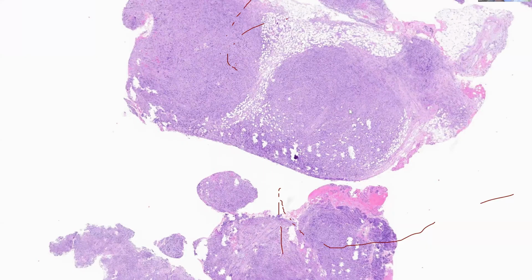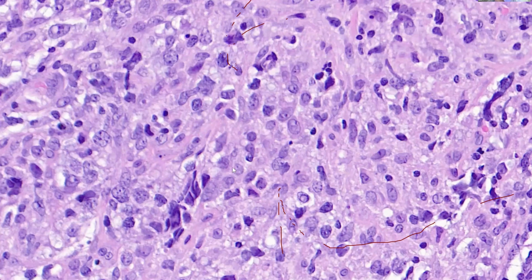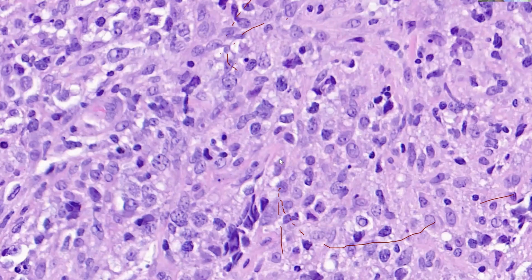All right, so you will have large nodules, and some fibrosis in the background. However, the large cell population are not typical RS cells, but rather B cells showing some immunoblastic type morphology.